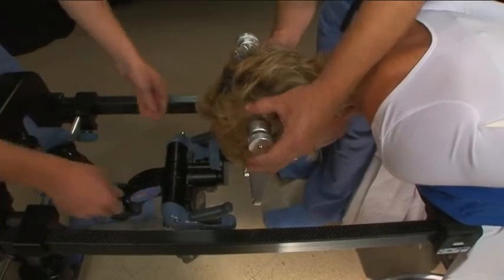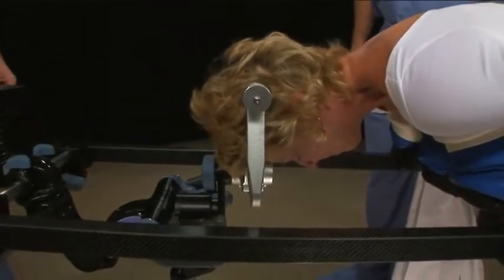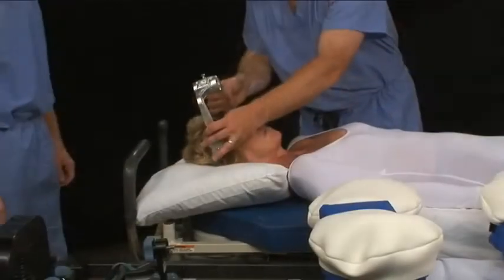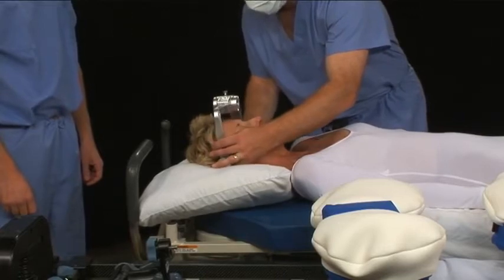If there is still play in the skull clamp after tightening the knob, try re-tightening it while a second person pulls up on the skull clamp. In the second method, the starburst adapter is attached to the C-Flex before transferring the patient.